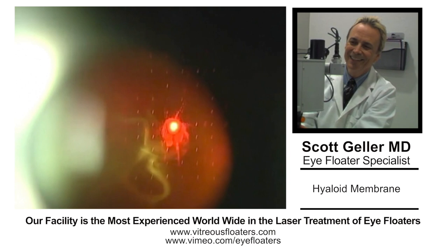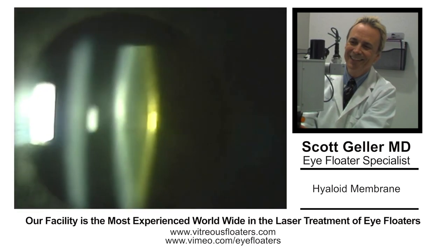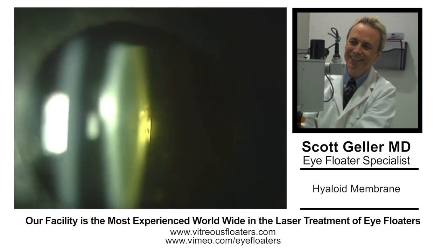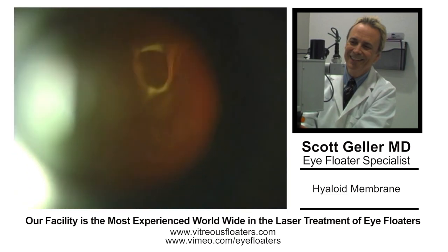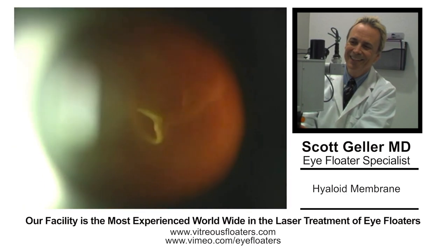I'm going to discuss an interesting case here. This patient had a hyaloid membrane — it's a little different than the average floater. Initially, we always tell the patient that they have a problem. This patient had a very small cataract.